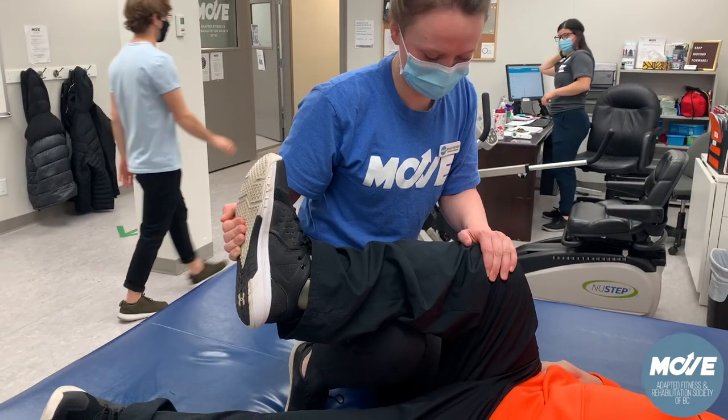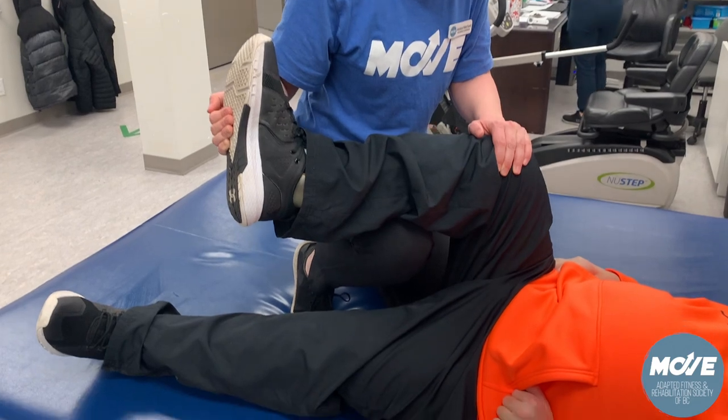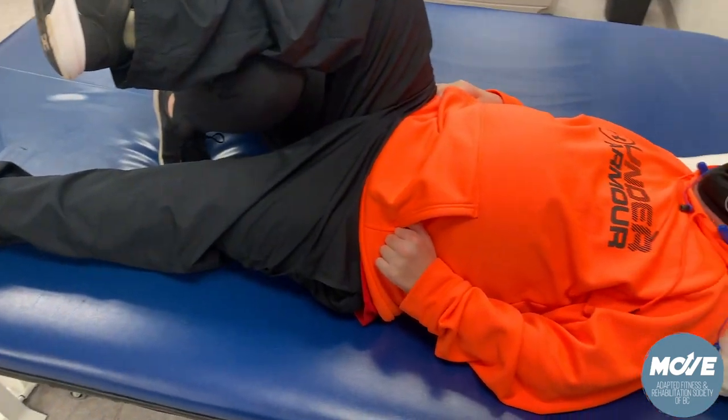Hi, I'm Jessica, I'm a kinesiologist at Move Adapted Fitness and this is how we use our plinth. The plinth can be used for a variety of strengthening exercises as well as assisted stretching by staff members or volunteers.